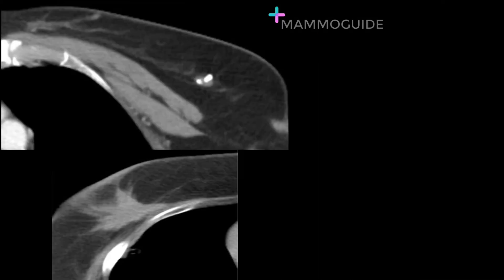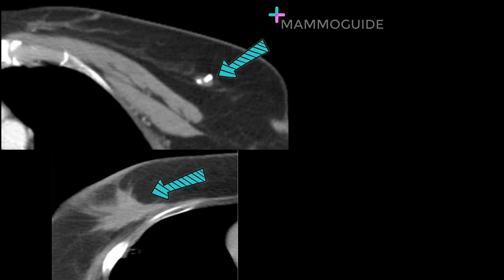Another patient was sent for diagnostic mammography evaluation based on "suspicious calcifications" and a "spiculated mass" within the breast. Here are the supposed suspicious calcifications, and here is the spiculated mass.